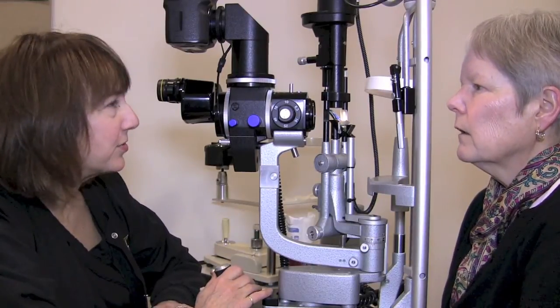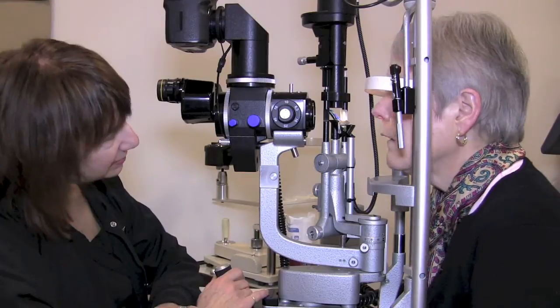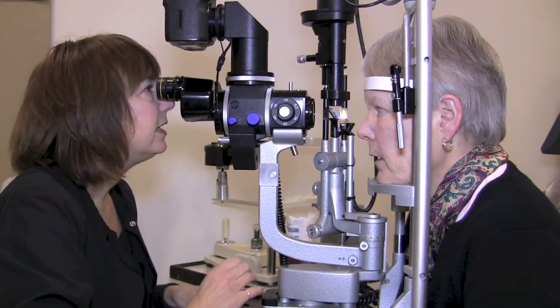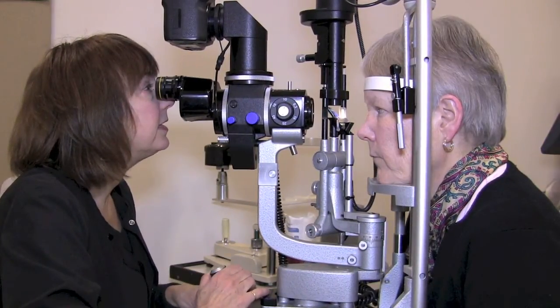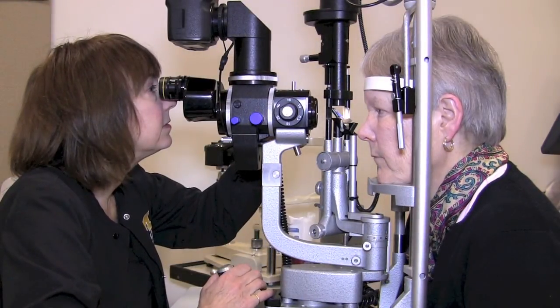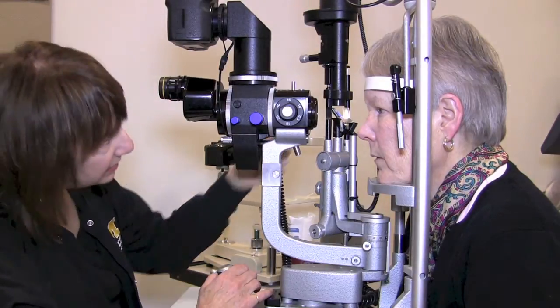Some cameras capture images of the external features of your eye, and some capture the inside of your eye. External photos are images of your face, eyelids, and cornea. They are taken for a variety of diseases such as infections, corneal dystrophies, and Graves' eye disease. These high-resolution images are captured on a slit-lamp camera, just like the one used by your physician to examine your eyes.